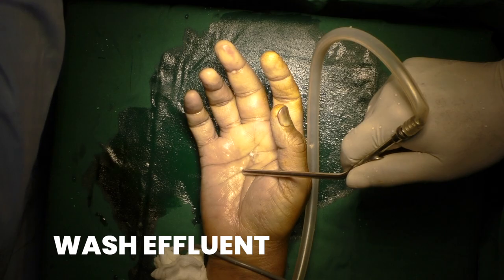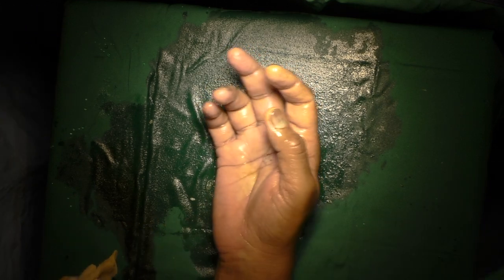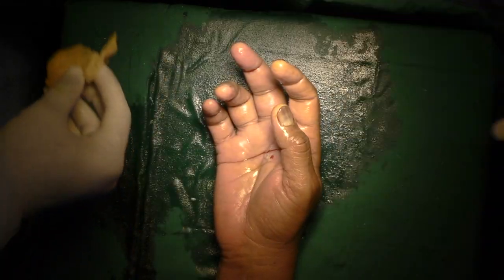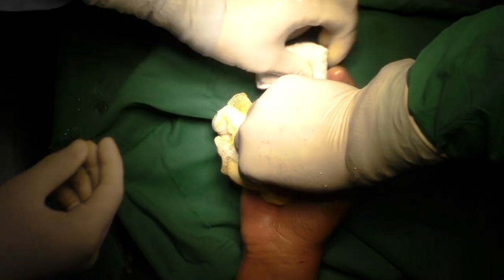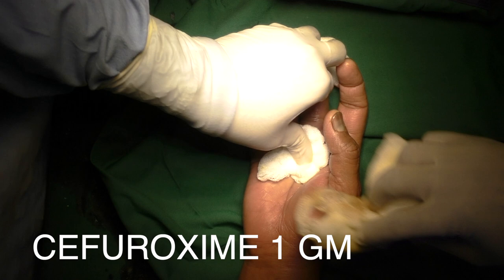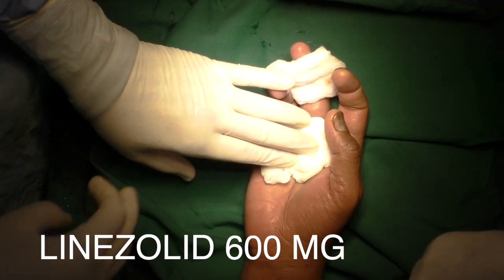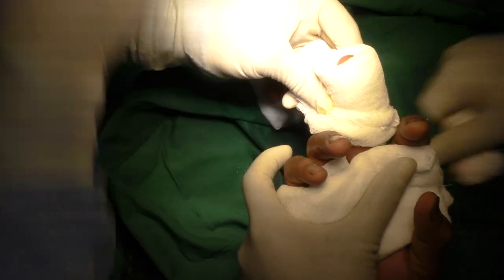Once the wash effluent is clear enough, tourniquet was then released. Gentle compressive dressing was done. Arm was kept elevated post-operatively. We started him on injection Cefuroxime 1g IV twice a day and injection Linezolid 600mg twice a day for three days, then switched over to oral antibiotics.